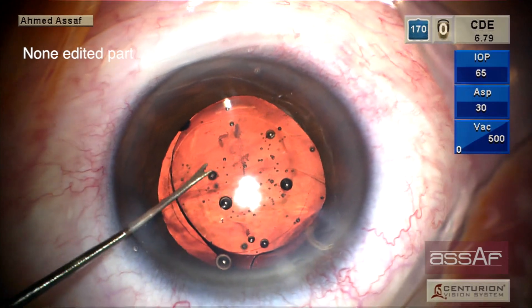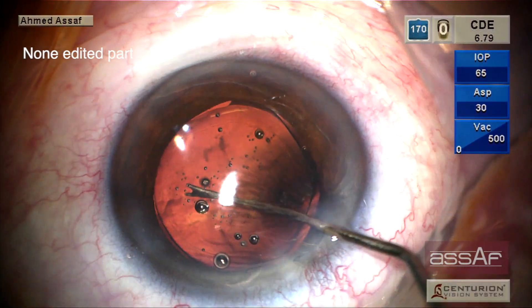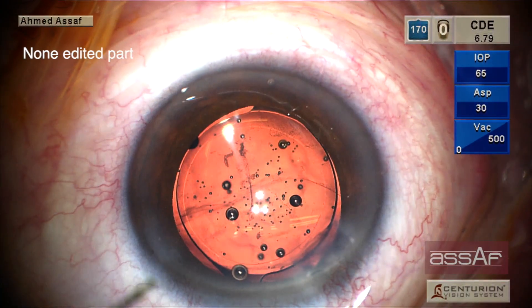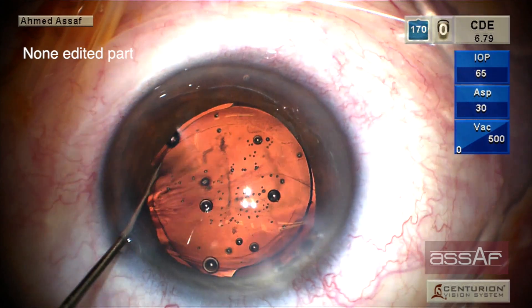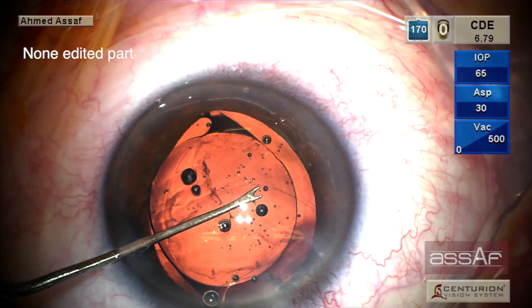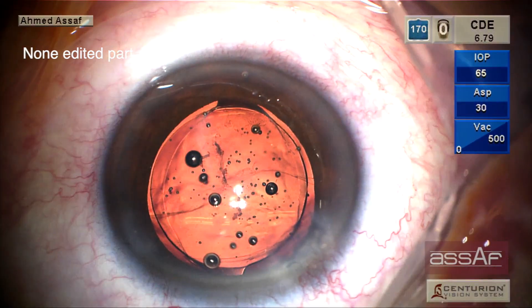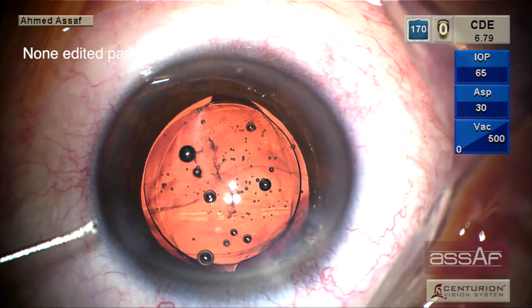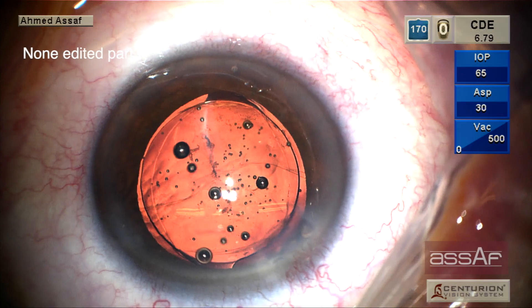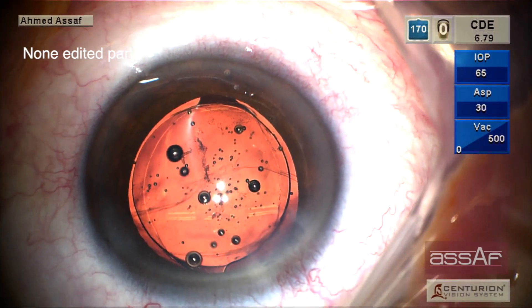Now the lens has been completely unfolded inside the capsular bag, supported from either side by the remnants of the posterior capsule. The lens is well centered, but to add extra stability, it's mandatory here to do the reverse optic capture. I'm popping out the optic above the rhexis, so the haptics are situated inside the capsular bag and the optic has been prolapsed into the sulcus above the rhexis.